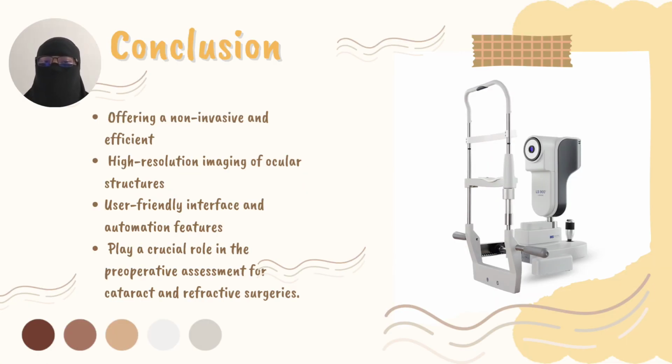Lastly, for the conclusion, the Lenstar LS900 has proven to be a valuable tool in modern ophthalmic practice, offering a non-invasive and efficient way of obtaining accurate measurements critical for optimal surgical outcomes. Its ability to capture a broad range of ocular parameters such as axial length, corneal curvature, anterior chamber depth, and lens thickness.